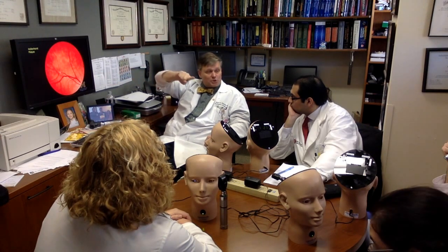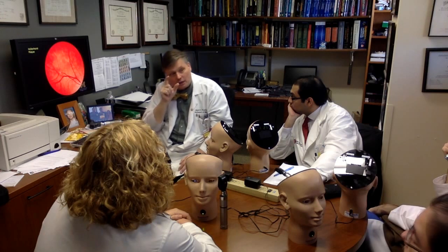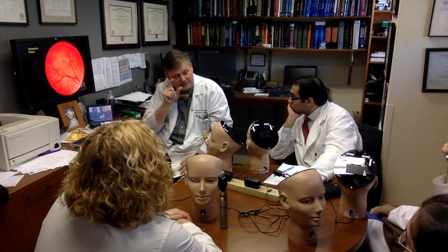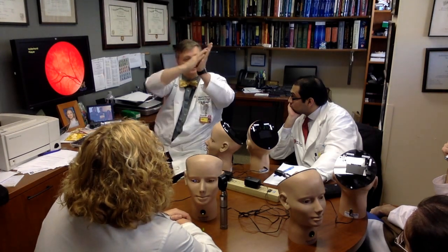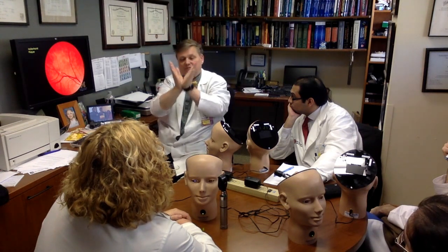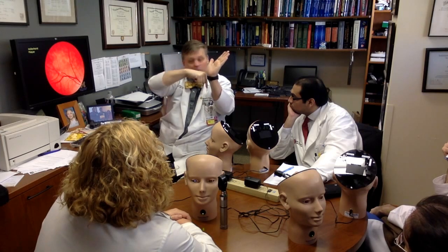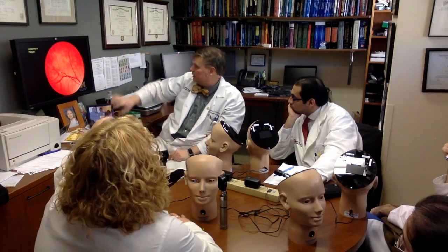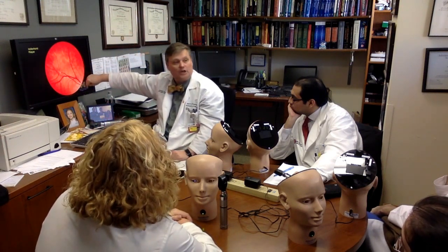Now, one thing we missed earlier on with the normal retina is that sometimes you'll look in the retina and you won't see the disc. You'll just see the retina and blood vessels. Where the heck is the disc? Here's the easy way. Blood vessels bifurcate, and when they bifurcate, they make a V. So if you don't see the disc, find the V and follow the point. So in this one, where do you think the disc is? Is it here, here, here? Cool. It's down here, right? Here's the V. Down it goes.